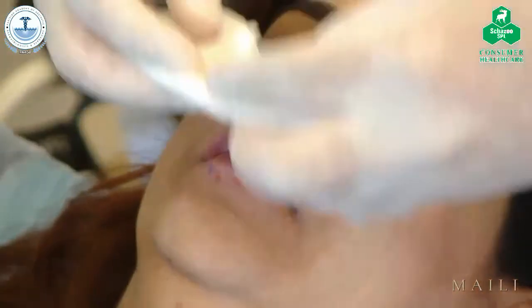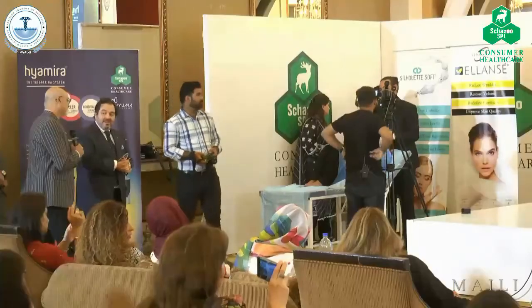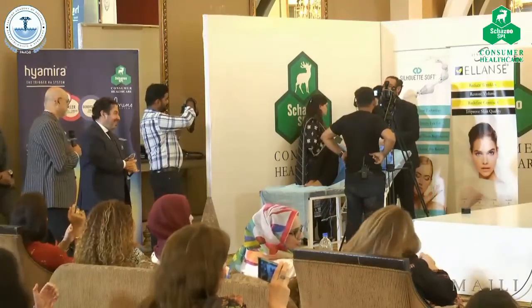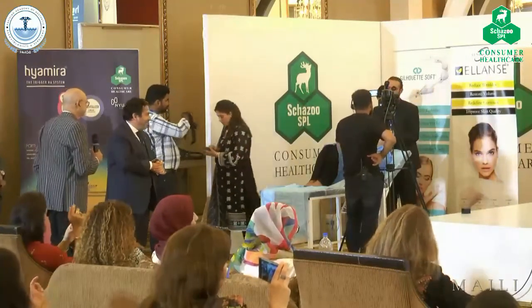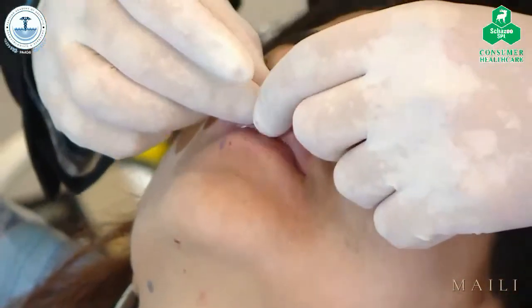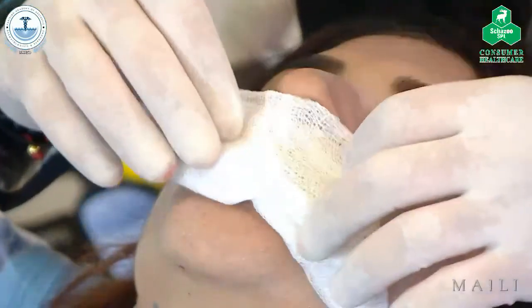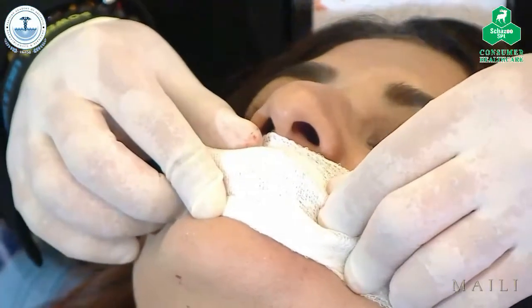Can I have some Vaseline? Rami, if you have a leftover, what do you do with it? Throw it away. Throw away, yeah. You will throw it away? In Pakistan? No way. Maybe I leave it for touch-ups 3 or 4 days after. You know what happens with the leftovers? You're going to place it somewhere that was not planned, and that is going to give you problems. And usually it's the last patient of the day. You're tired, and it's before a weekend, and you're just going to see them on Monday. So I just keep it out.